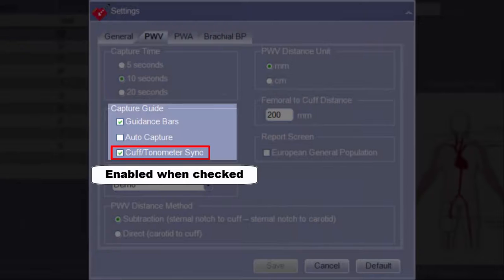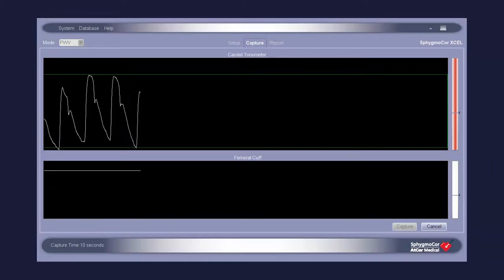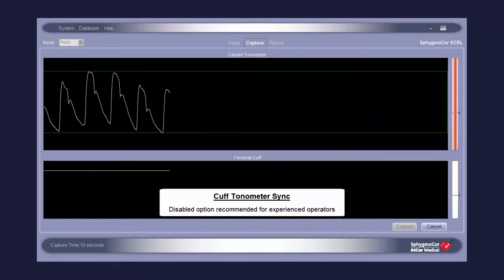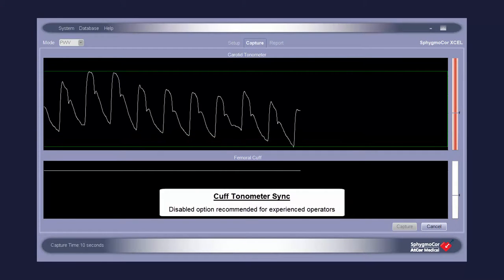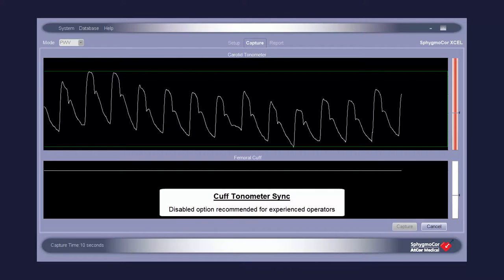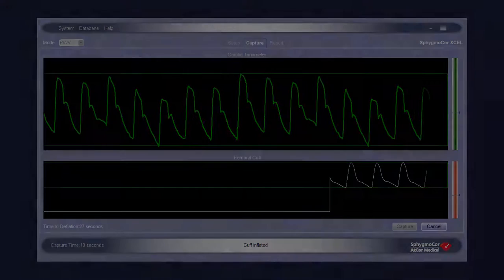Cuff Tonometer Sync is an option that, when enabled, delays the inflation of the thigh cuff until a carotid waveform of sufficient quality has been acquired. This setting is advantageous for new users practicing tonometry technique. However, experienced users may find disabling this feature allows for a more time-efficient assessment, since the cuff inflates immediately upon capture initiation.